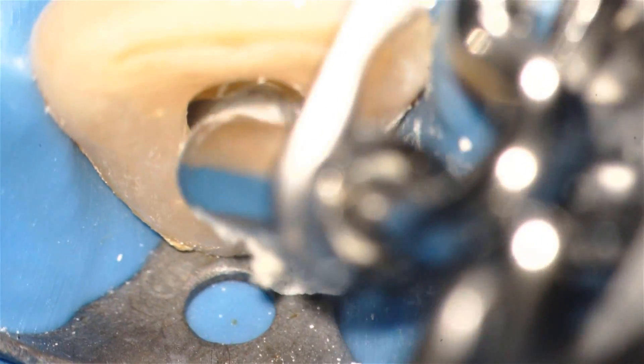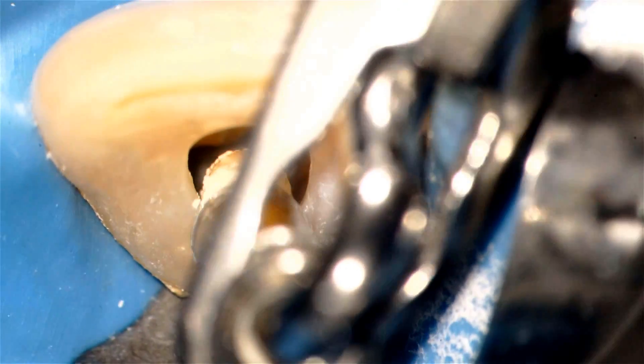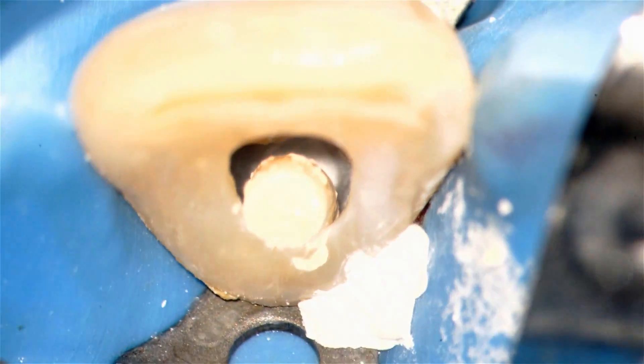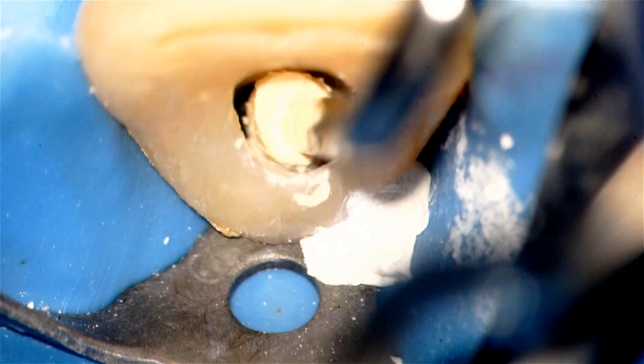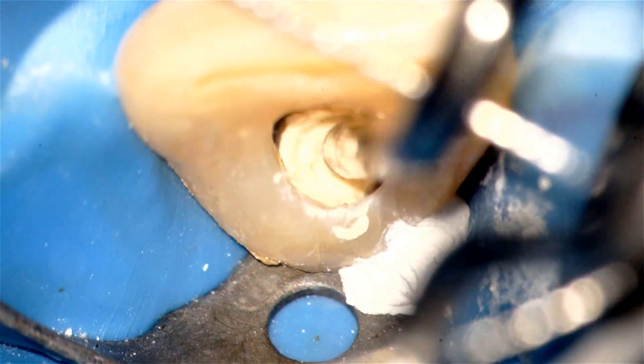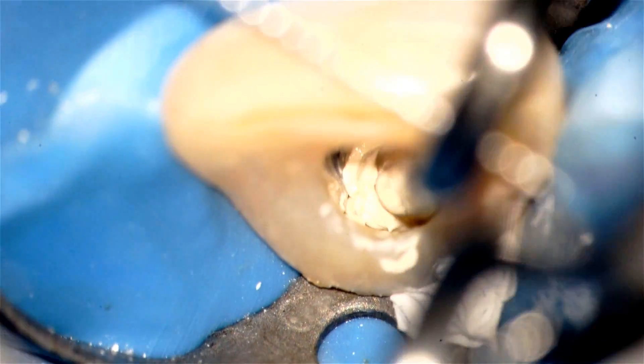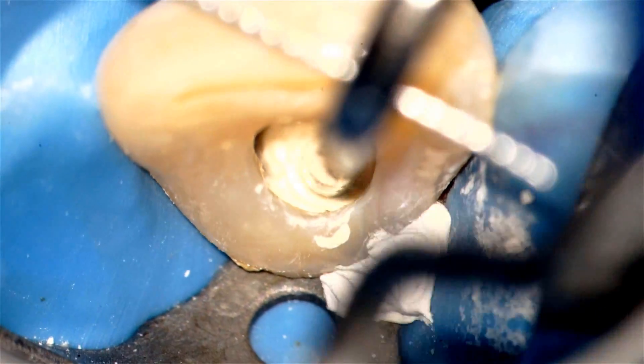Now I'm placing Biodentine. Biodentine has very good compressive strength properties, and so it's an ideal material to place in a large defect like that. It also has bioactive properties, and it stimulates calcification when it's opposed next to tissue fluids down deep in the sulcus.